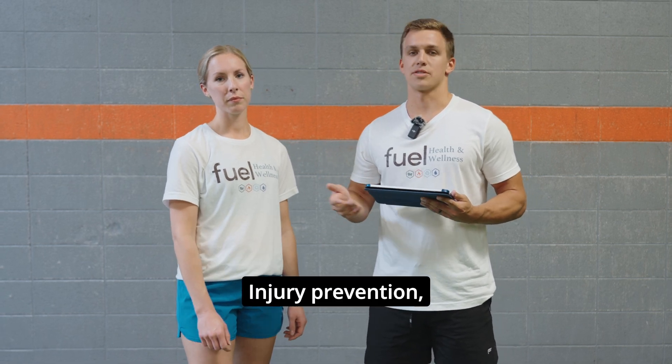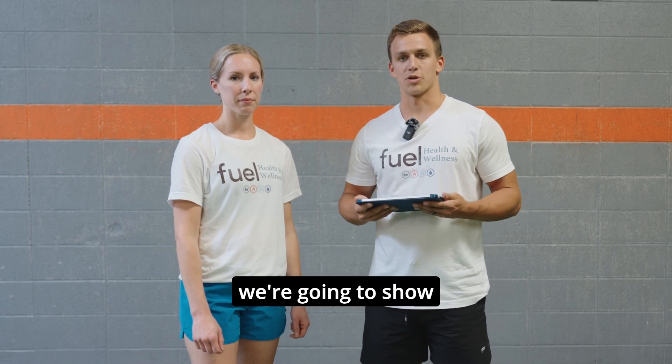How can we improve your sport performance? Injury prevention, especially for athletes in high school and college. So that is what we're going to go through today. We're going to show you how it all works.